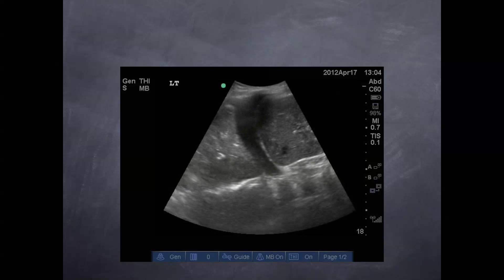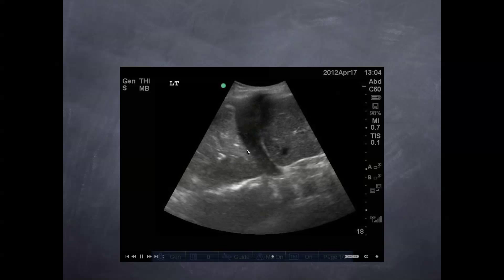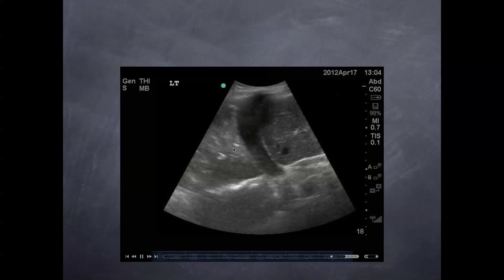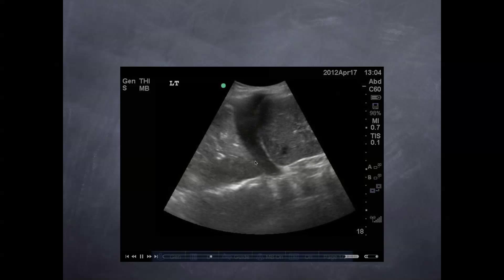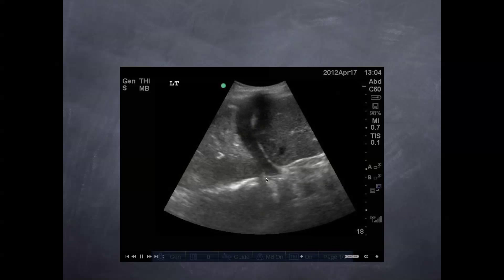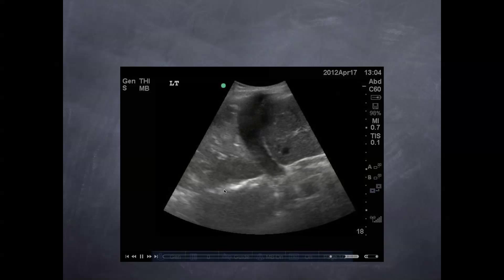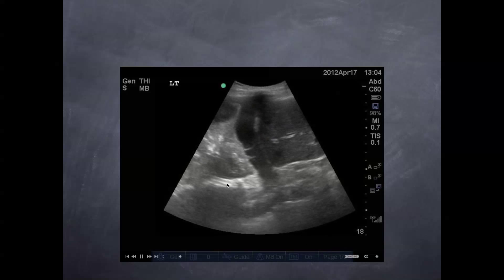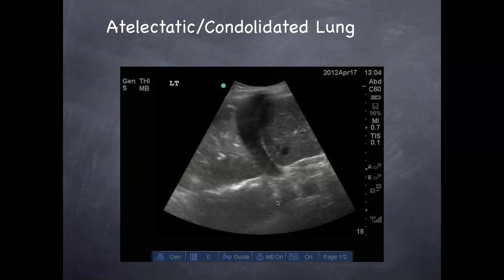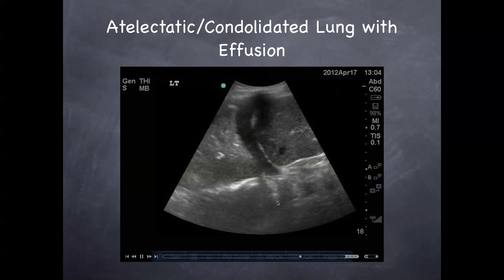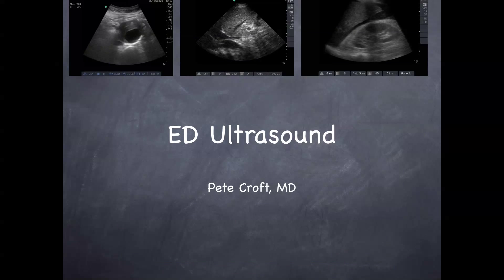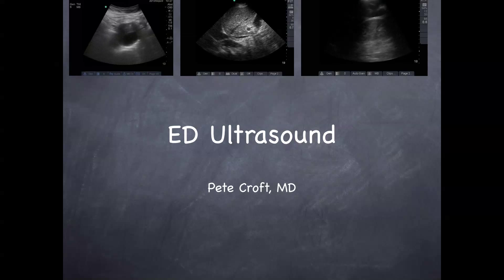And lastly, a nice consolidated atelectatic lung with fibrinous strands and a concomitant effusion. Notice the spine sign here — you know something's going on. Hope that helps with the lung. Next we'll be moving on to the aorta and the IVC. Thanks.